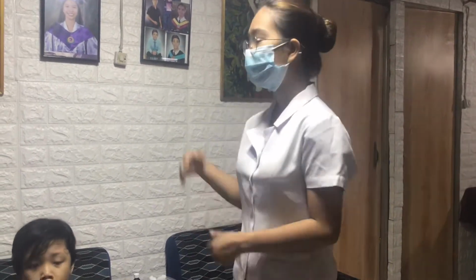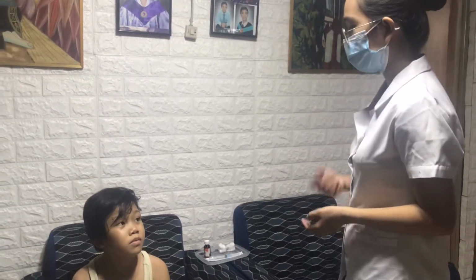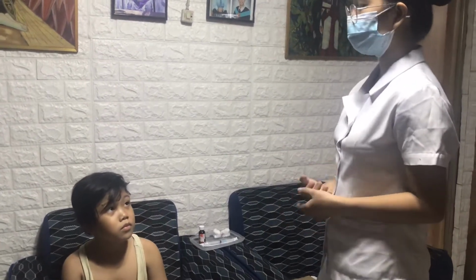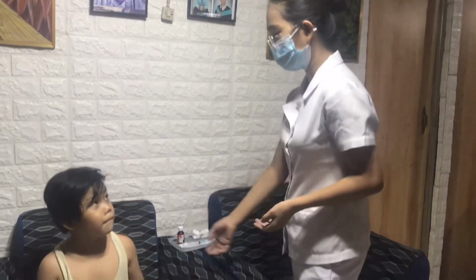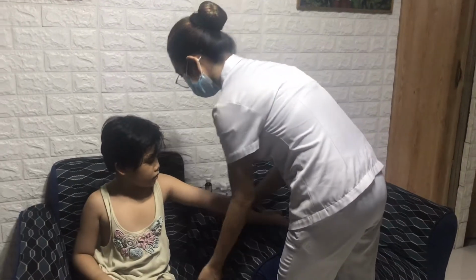After choosing the injection site, the next thing to do is to position the patient's arm so that the elbow and forearm are supported on a flat surface. Good day, ma'am. Again, my name is Casalangi Lumanta, and I will be performing the administration of medication. First, ma'am, can you put your elbow or your arm on this flat surface?